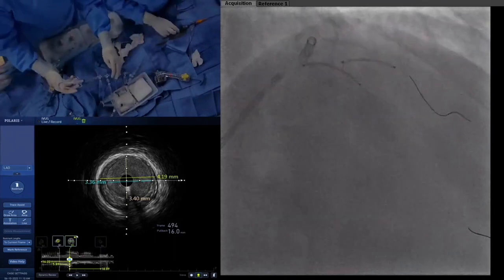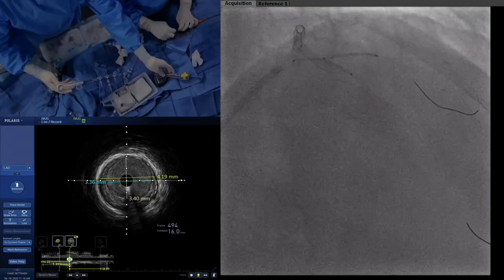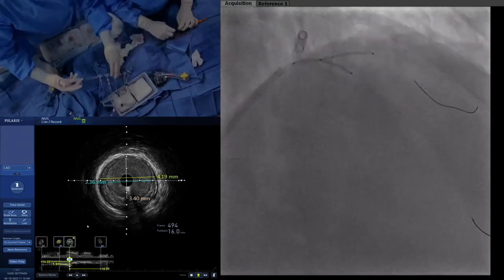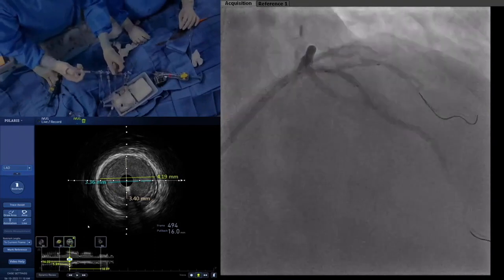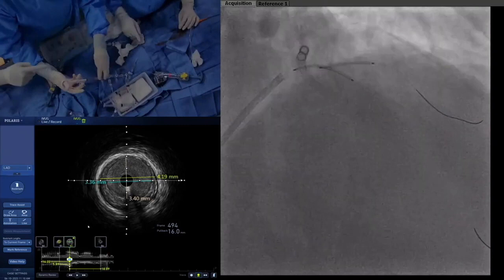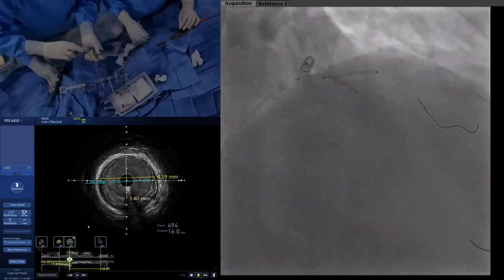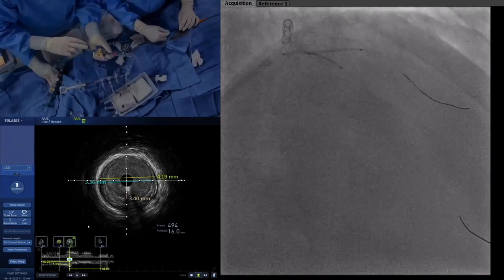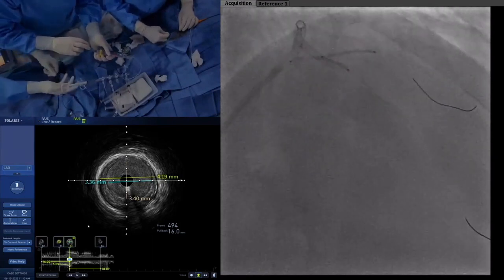Now we'll bring the stent on the diagonal. Tony, what has been your anecdotal experience with the high-risk restenosis area, the ostium of the side branch, compared to a DK crush or something? This is the diag. The only way to avoid restenosis of the side branch is to do angiographic follow-up. Okay, we take a cine now.